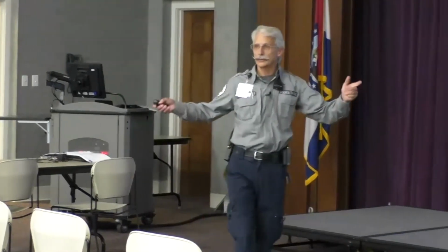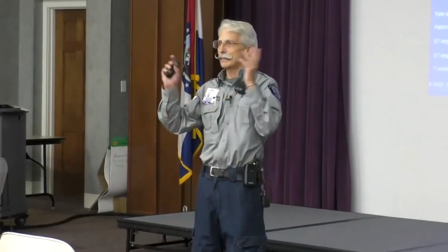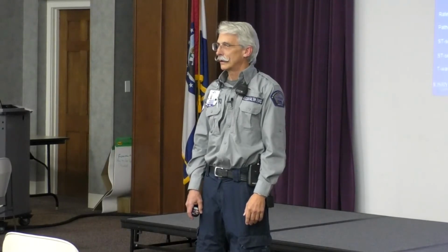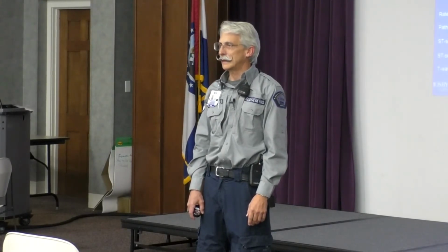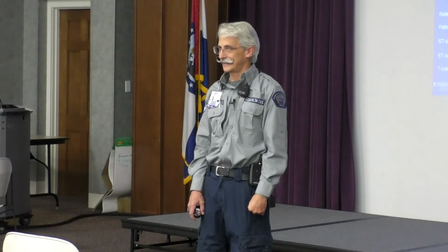Another quick question while I'm thinking of it. You're looking at your monitor, you've got a LifePak 15 or a 12, and you can see 3 leads on there, and they may or may not have elevation or depression. Does it mean anything if they have elevation in those leads? It does not.